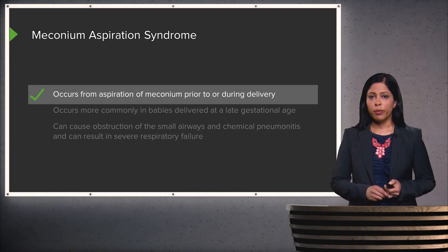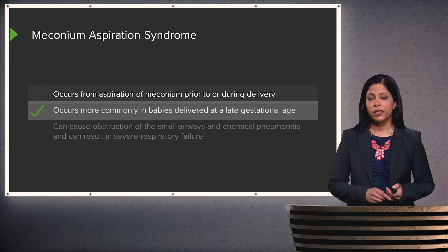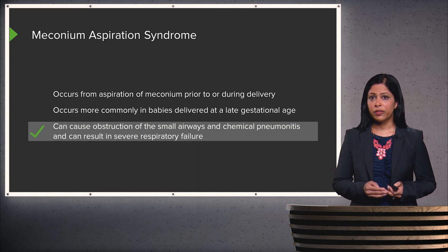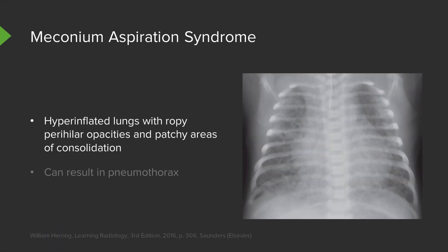Meconium aspiration syndrome occurs from aspiration of meconium just prior to or during delivery. This occurs more commonly in babies delivered at a very late gestational stage, and it can cause obstruction of the small airways and result in chemical pneumonitis, which can lead to severe respiratory failure. The lungs appear very hyperinflated, which is commonly seen. You also see ropey perihilar opacities and patchy areas of consolidation. In the perihilar region you can see ropey opacities in both lungs, and there's consolidation silhouetting the right hemidiaphragm. This can result in pneumothorax, which, if large enough, can lead to cardiopulmonary collapse.